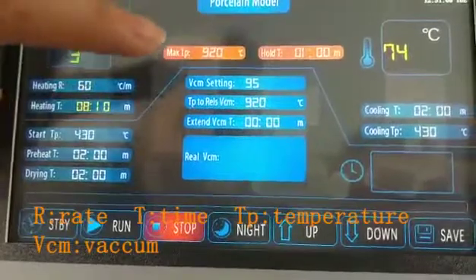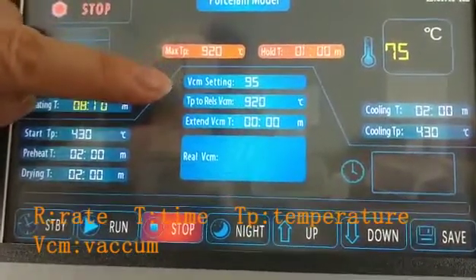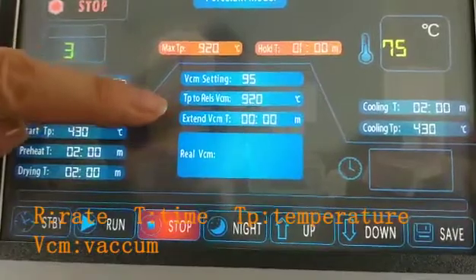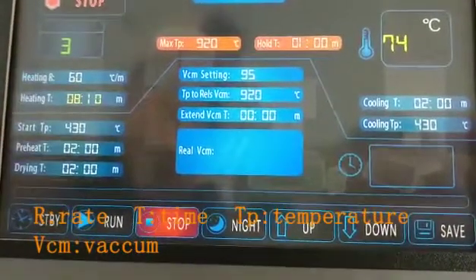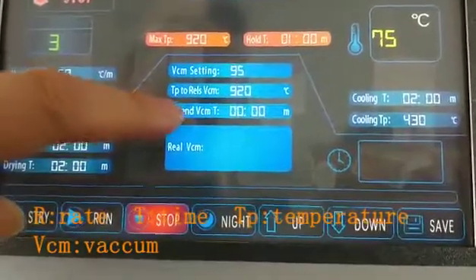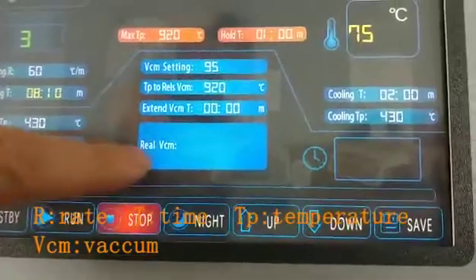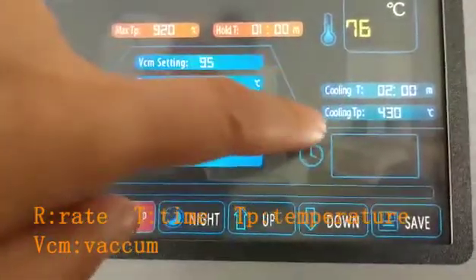This is the holding time, and this is the vacuum value you will set. This is the temperature at which the vacuum will be released, followed by the extended vacuum time, real vacuum time, cooling time, and cooling temperature.